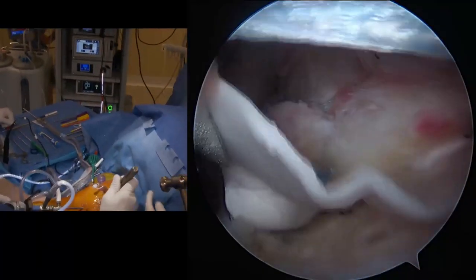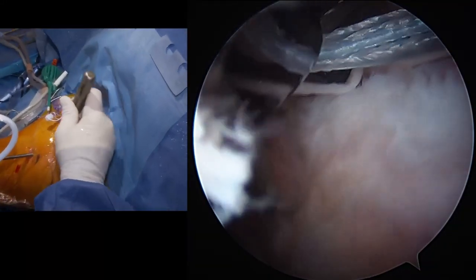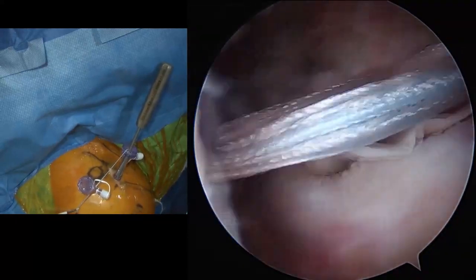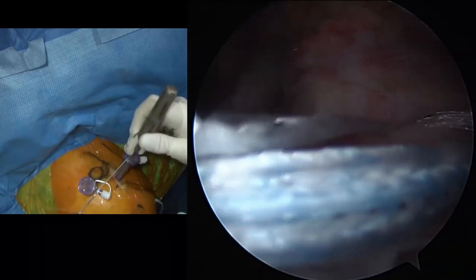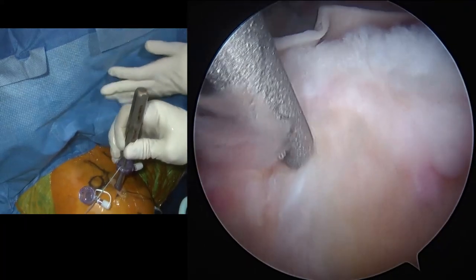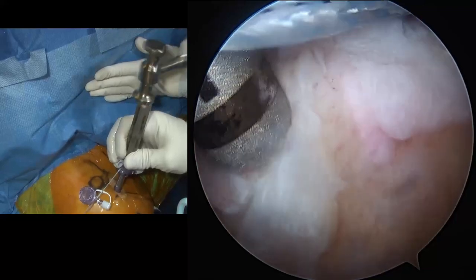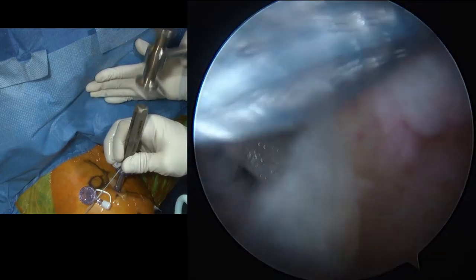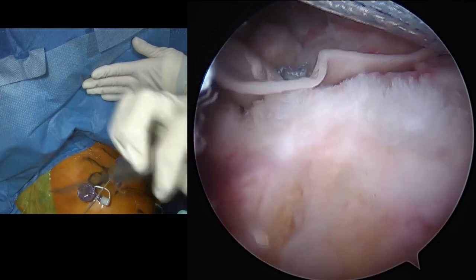And again, here's the front edge of our supraspinatus right there. So we want to be to about right here. So let's just rotate this back a little bit. Chris, let's go right here. Hold it right there. Yep. And we just don't want to go too far off that front edge. So let's go right down the leading edge. And that should be a good spot for us right there. So go ahead and hit that. Chris, I'm going to have you grab the scope in a second. Okay, that looks good. All the way down to the swivel lock line. And our anchor is ready to go. We'll hold the scope there for me.